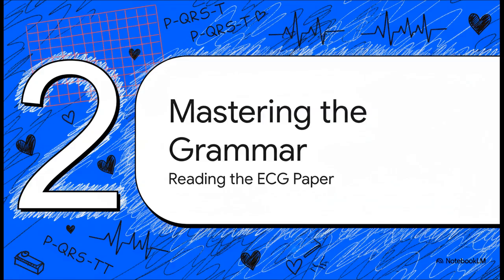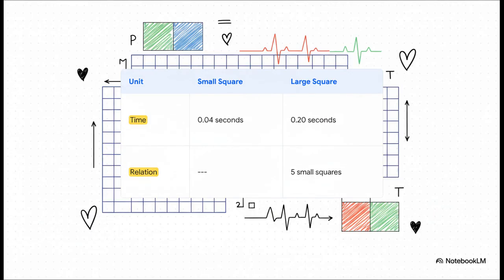Okay, so we've got the letters down, but just knowing letters doesn't mean you can read a book, right? You need grammar. And in the world of ECGs, the grammar is all about the rules of that grid paper it's printed on. Let's see how this whole thing comes together. So this grid is everything. Literally, everything on an ECG is measured against it.